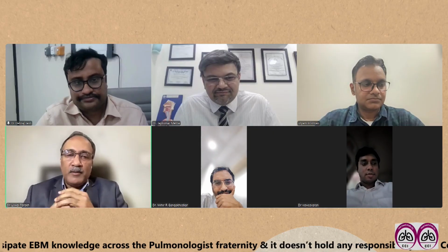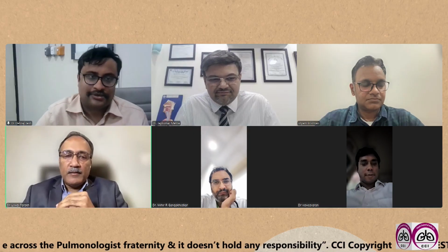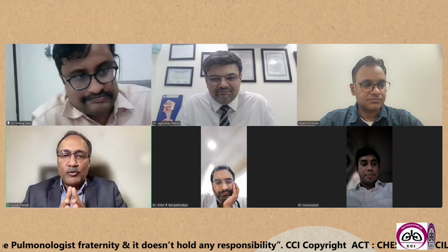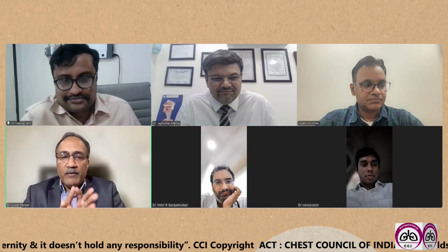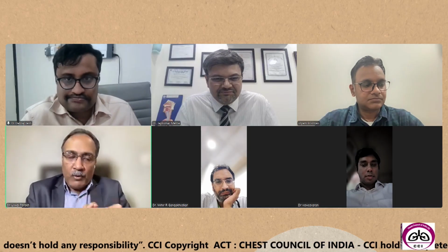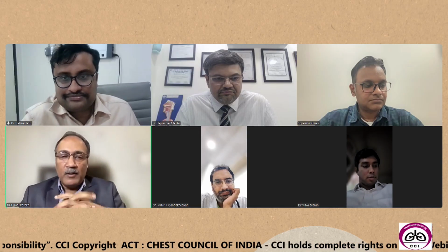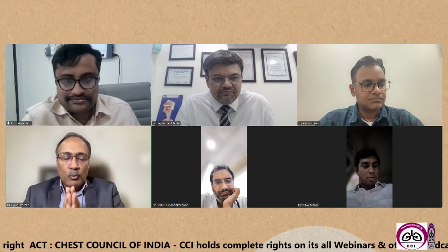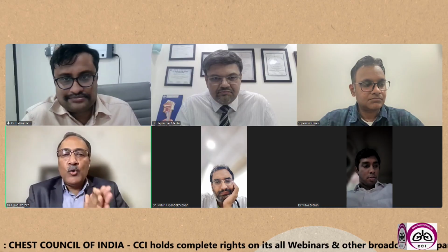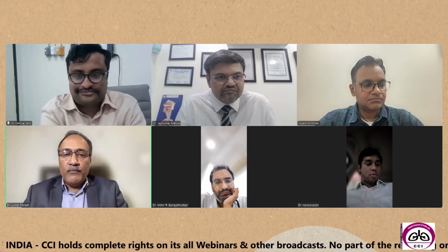Ujjal sir. I would say that EBUS is a good diagnostic procedure, and my take is it should not be put into the IP. It is outside the IP. We are not doing too much intervention. We are just taking a sample from a lymph node. So it is just like an extension of bronchoscopy, which does endobronchial work, and this does the extrabronchial work. So it's probably not an IP. Therefore, whosoever is not doing IP can still go and do EBUS. It will increase their knowledge about what the patient is suffering from and probably improve the patient outcome.